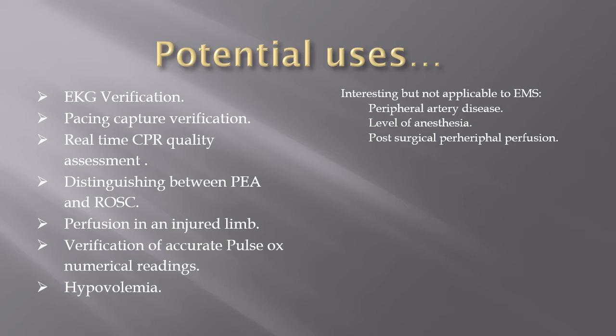Some of the interesting but not applicable to EMS applications are post-surgical peripheral perfusion, levels of anesthesia, and peripheral artery disease. As science continues to explore the use of this technology, more and more uses are being found for it as well.